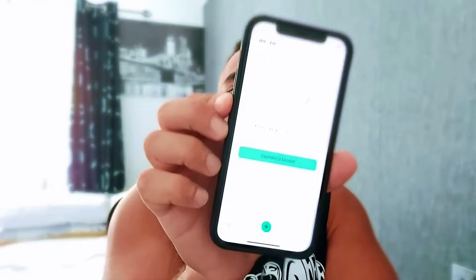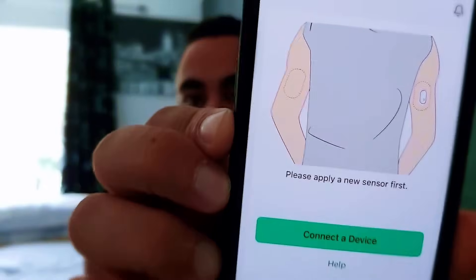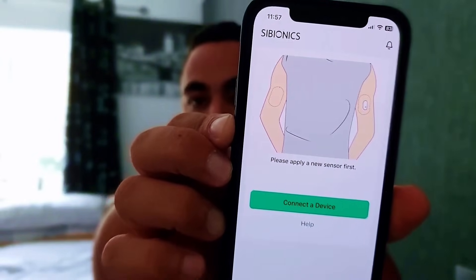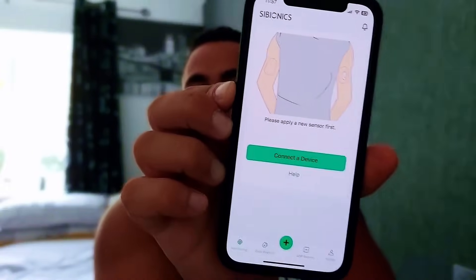I'm going to show you the app quickly before installing it. This is how the app looks — all you're going to do is click 'Connect Device,' and that's when you're wearing it. So I'm going to go through the installation first, put on the device, wait for the warm-up time, and then carry on with the video.